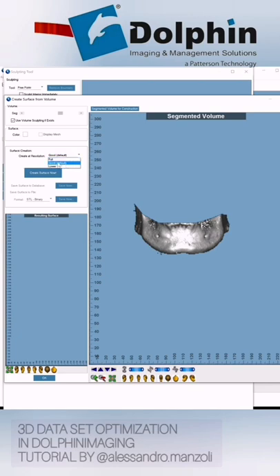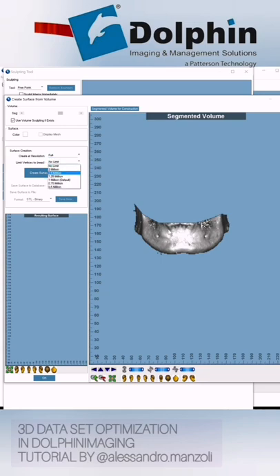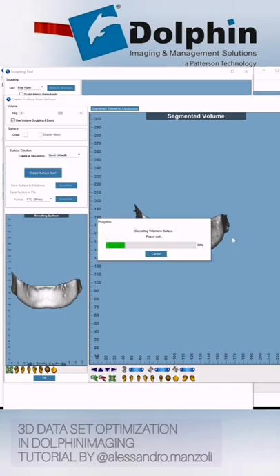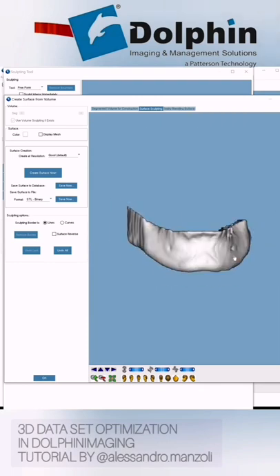Always choose Good. If you go to Full, you have an additional option where you can define the number of vertices you want to create, but this will create a surface that is way larger and will use much more memory. So stay on Good, unless you have a very small surface — then it makes sense to go to Full if you are taking just a little piece of a patient. But if you want to segment the mandible, the maxilla, and so on, stay on Good and then create the surface. You will still have a very good representation of your surface.